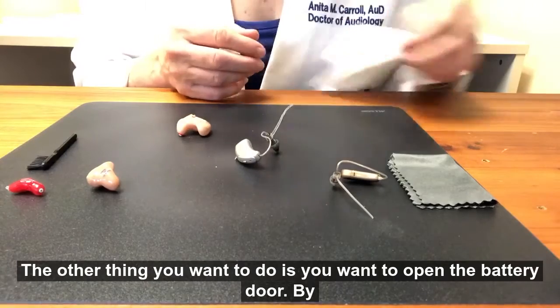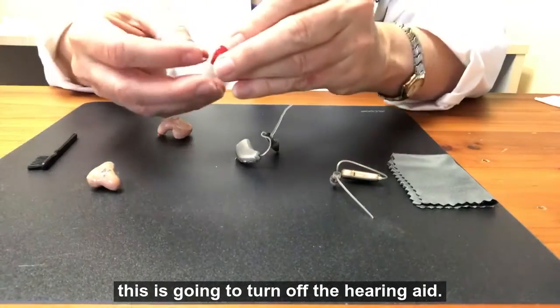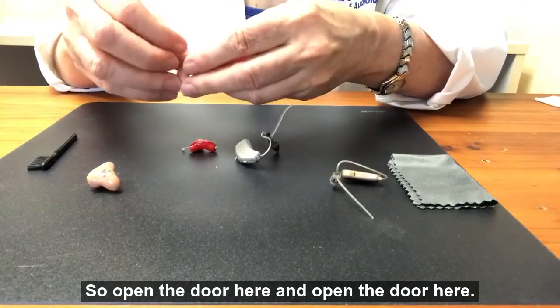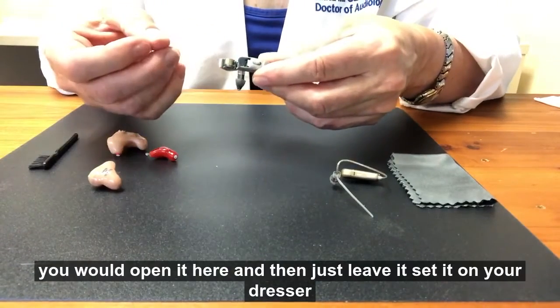The other thing you want to do is open the battery door. By opening the battery door, this is going to turn off the hearing aid. Open the door here and open the door here — that will turn the hearing aid off. On this type of instrument, you would open it here.